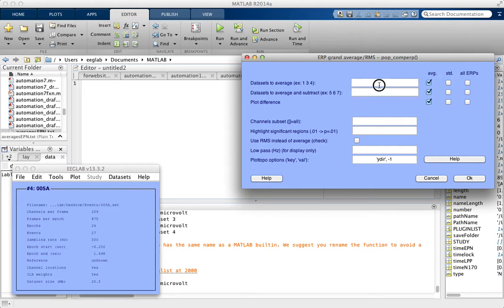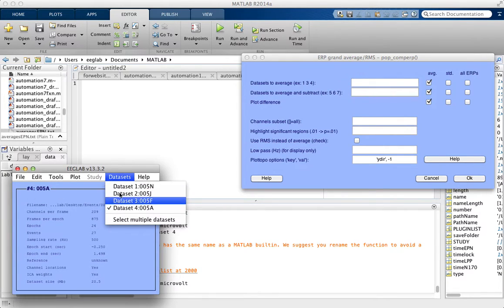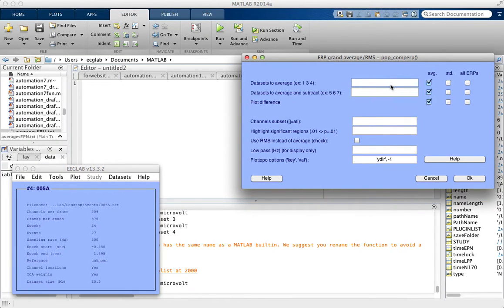This field shows the dataset numbers — one, two, three, four. We want to average all of those together, so we're going to enter one colon four to select all four of those.